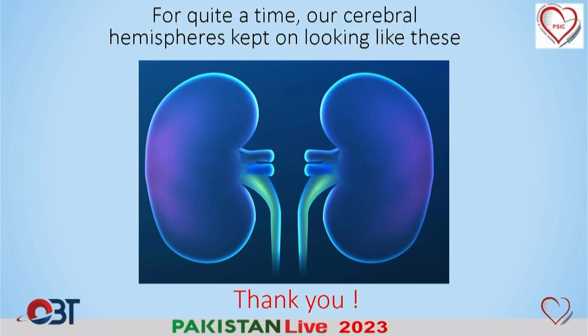So next slide, please. So that was the thing. That was all the time in the mind. So I agree, various options can be taken. This was one of the options which the operator selected, and he was successfully able to do it with zero contrast. And there are a lot of case reports currently doing nano crush for zero contrast. So they are getting popular, using IVUS for optimization and taking a final single shot.